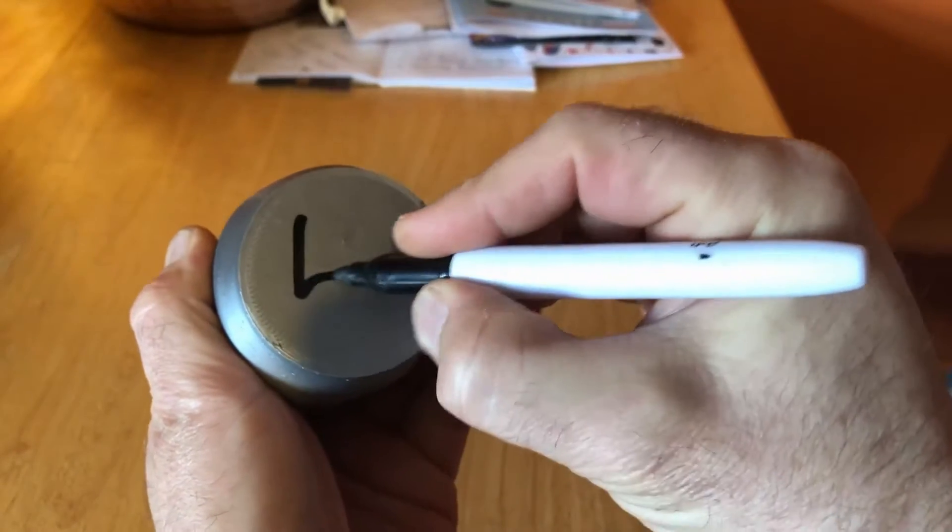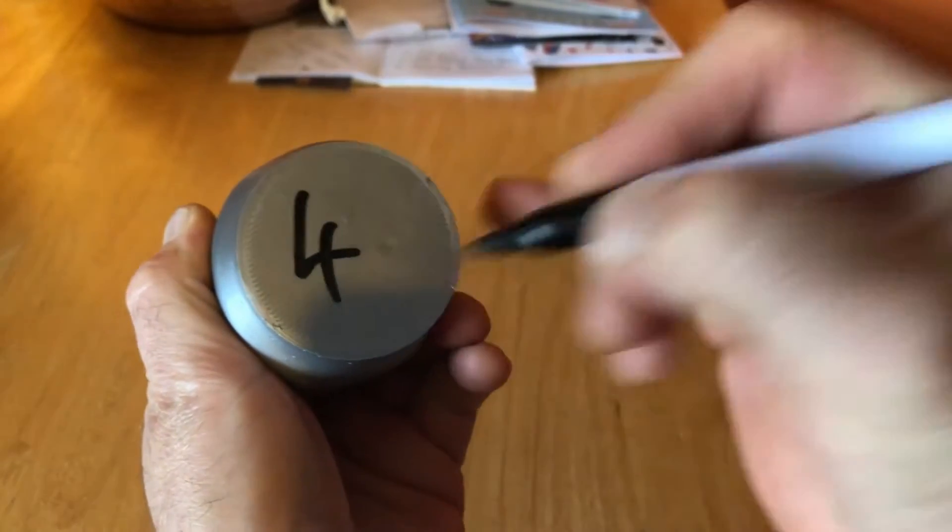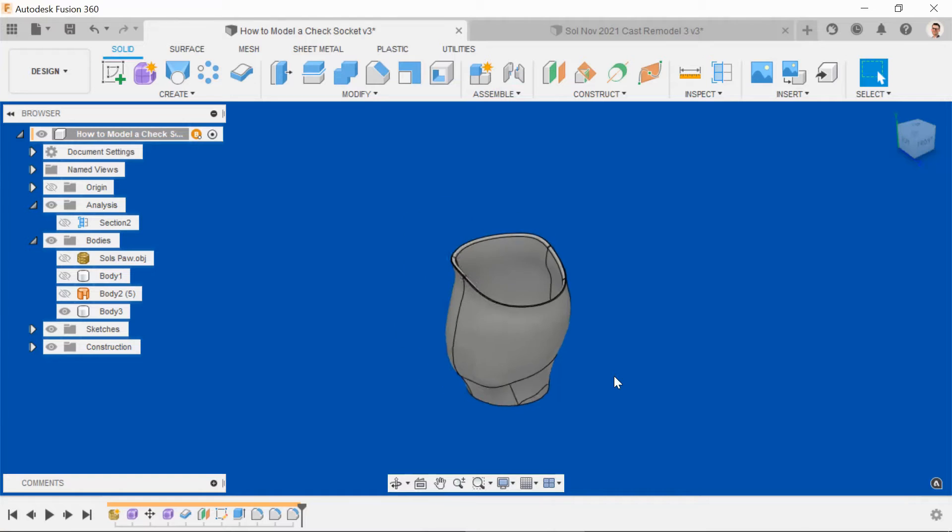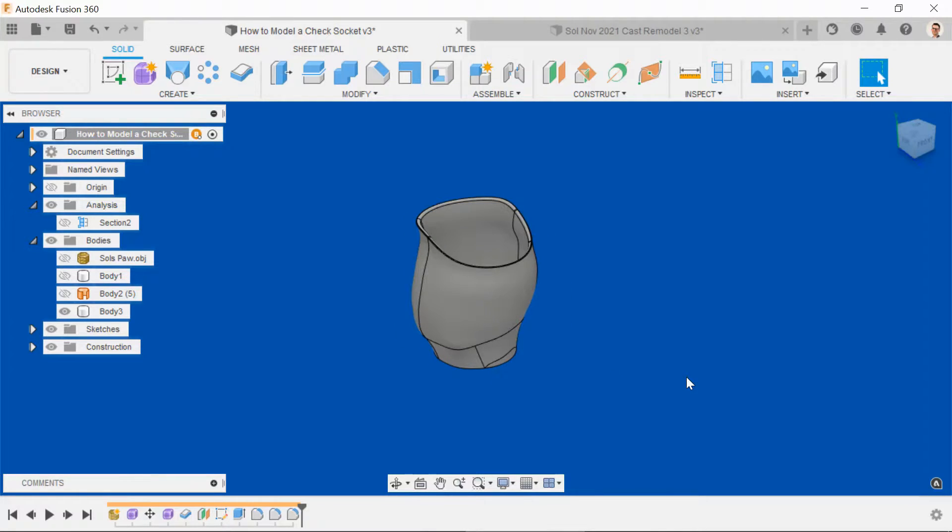Every time you make a change, save the file, label the file, keep version control. So I'll print this off now, and hopefully in a couple of hours, we'll be ready to test it on Sol's arm.